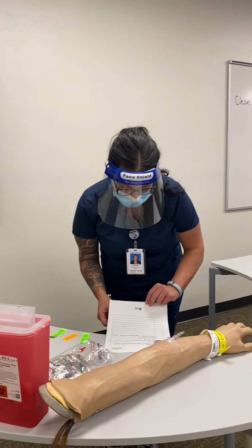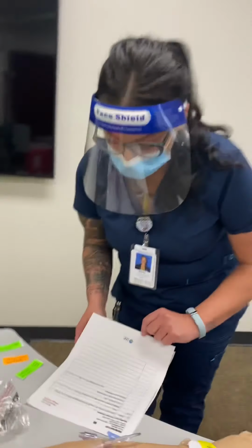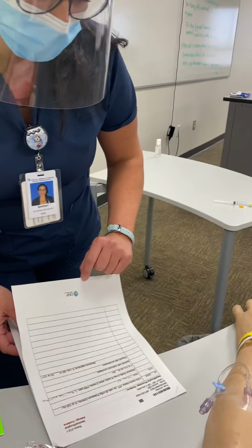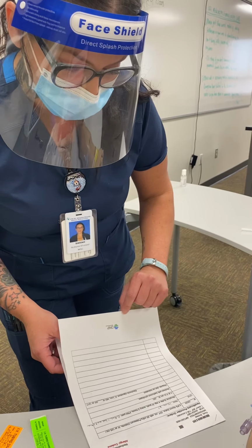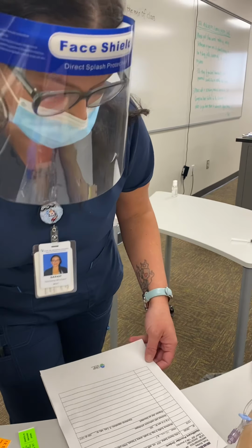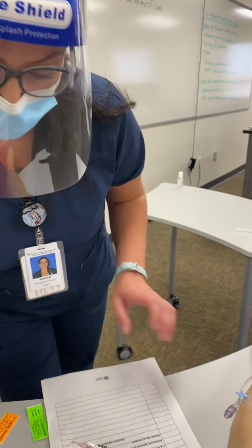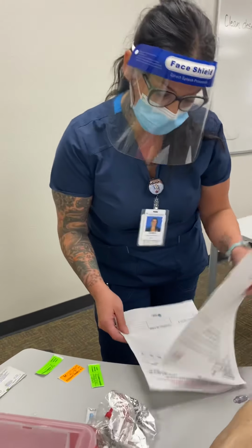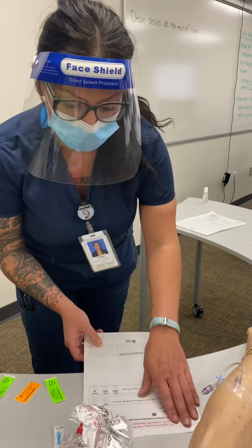So the doctor has ordered the patient to receive 20 milliequivalents of potassium chloride, diluted in a bag of 0.9% normal saline, 250 mils of that, to be infused at 125 mils per hour, as well as morphine sulfate 4 milligrams IV push every 2 hours as needed for pain. I need to compare that to the MAR and make sure everything matches, and it looks good. So I can go ahead and get the medication.